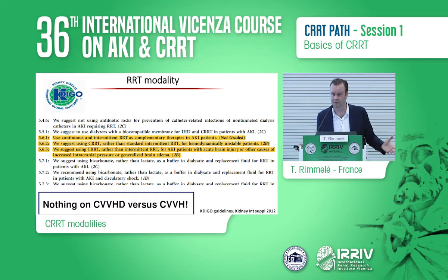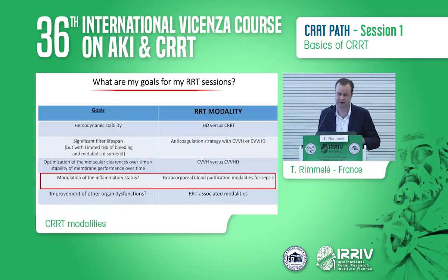However, when you look at the KDIGO guidelines, nothing about the debate CVVHD versus CVVH. Okay, so you should be able to use both therapies. But again, if you use CVVH, don't forget to calculate the filtration fraction.